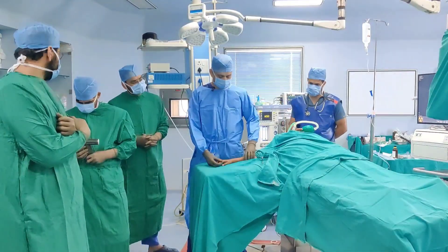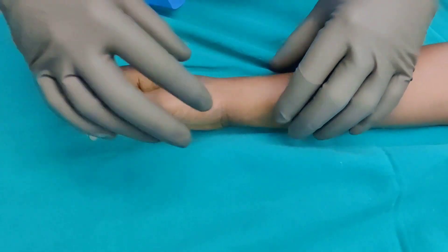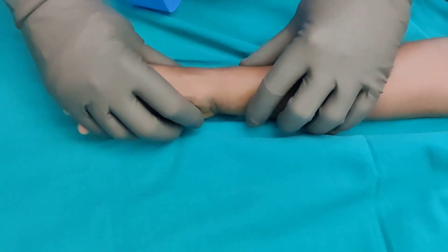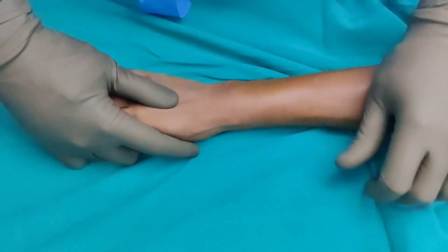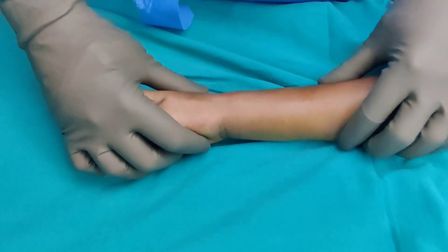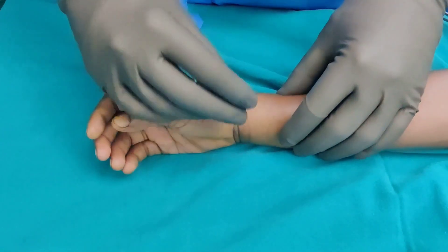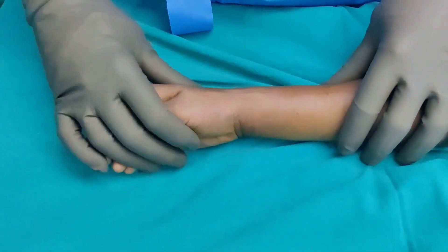Next I want to show you the deformity of this fracture. Looking at this hand it does not look too bad, but there will be occasions where the distal fragment is completely off and angulated. These are the most difficult fractures to reduce where we use the principle of increasing the deformity and then reducing it to achieve a good reduction. Even on AP it does not look bad, but this is one fracture which can be quite difficult to reduce and keep in reduced position. A small percentage will have pronator quadratus interposed, usually seen when displacement is more, and it button-holes through the pronator quadratus making satisfactory reduction impossible.